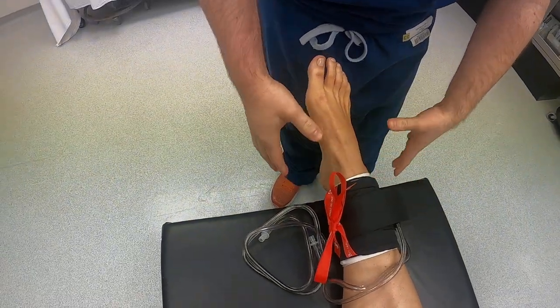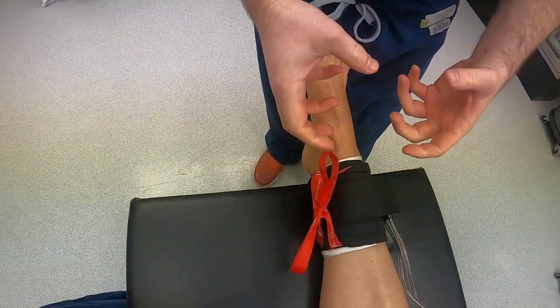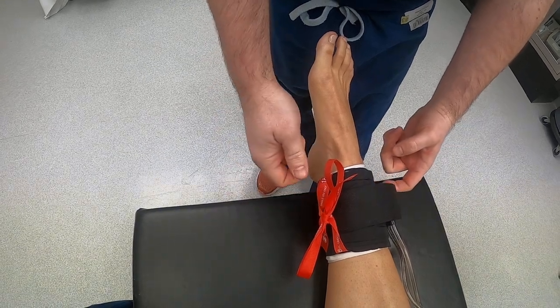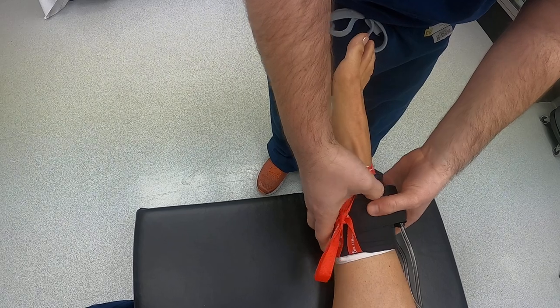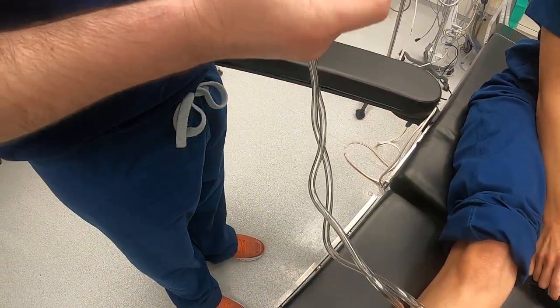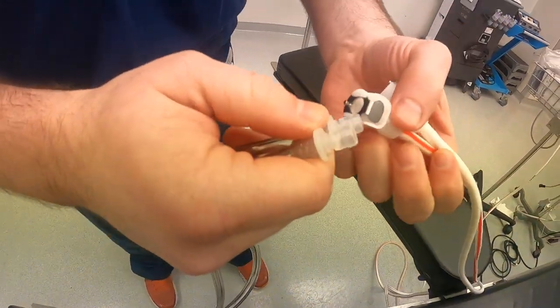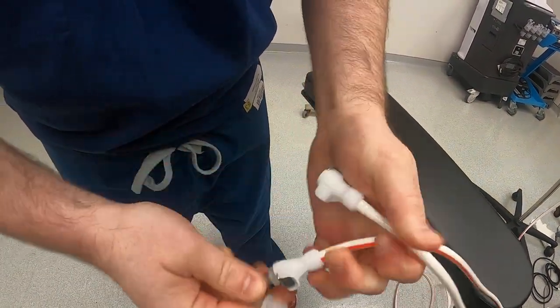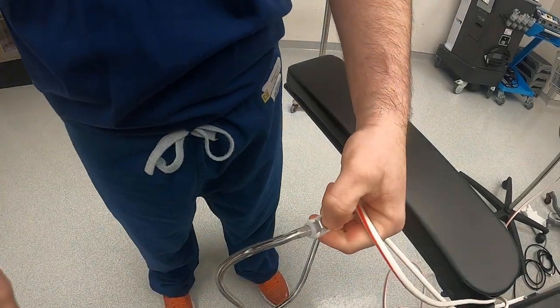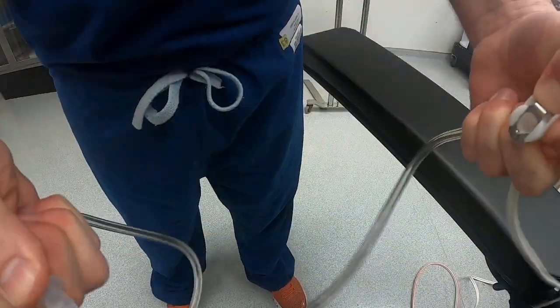You can prep all the way up to the tourniquet. Certain things should be placed around it to protect it from both the surgery and the prep solution — for example, a 10/10 drape, which is a sticky drape that wraps around, or a blue towel secured with a towel clamp. Something should protect that tourniquet from getting too dirty. Finally, connect the two leads from the tourniquet machine — it doesn't matter which lead attaches to which port. To release them at end of case, push down the metal clamp and the leads pop off.